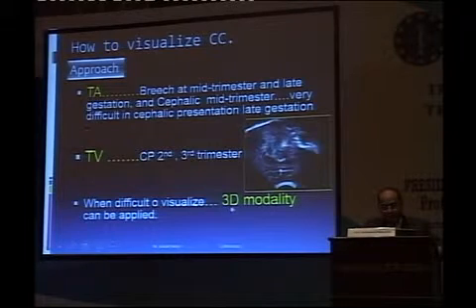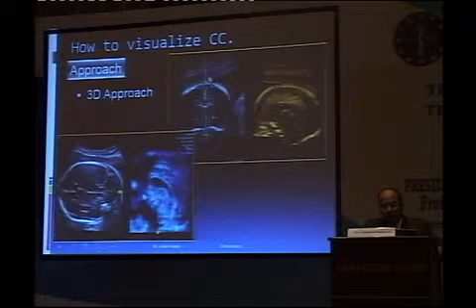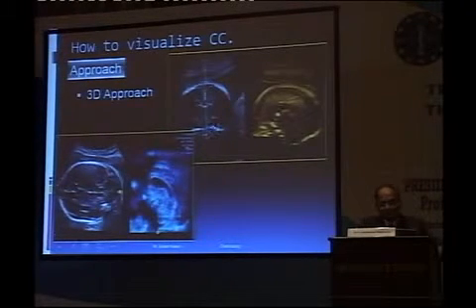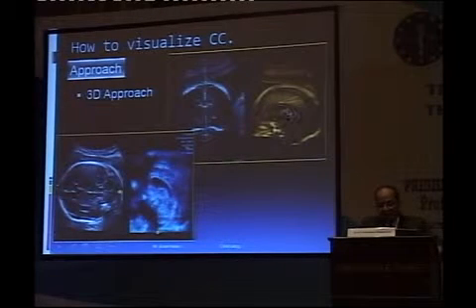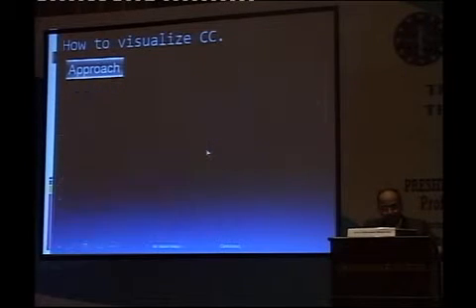When it is difficult, 3D could be offered, and we can do our cut in the mid-sagittal plane, and easily you can obtain the whole parts of the corpus callosum. We can see here this is the cavum, and this is the corpus callosum.